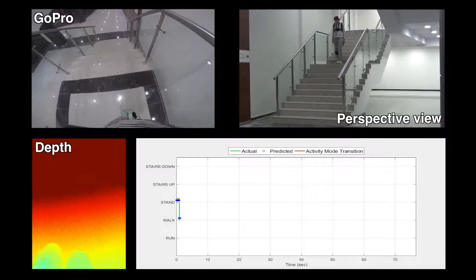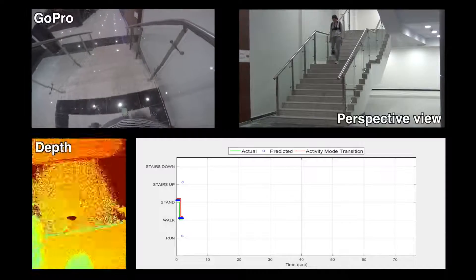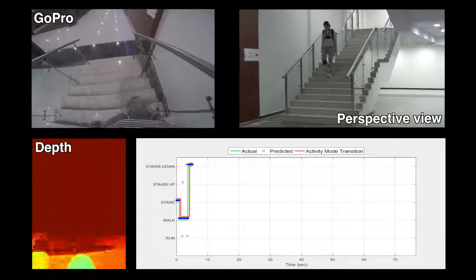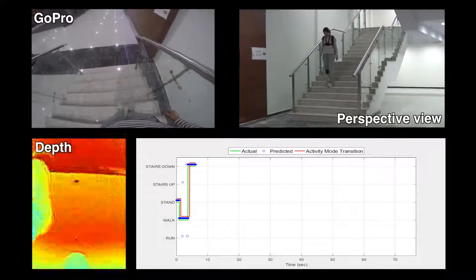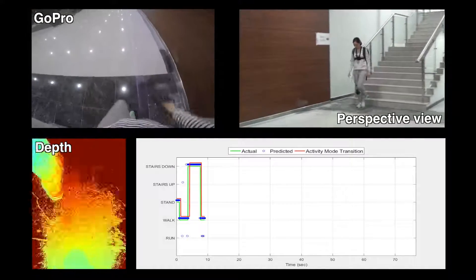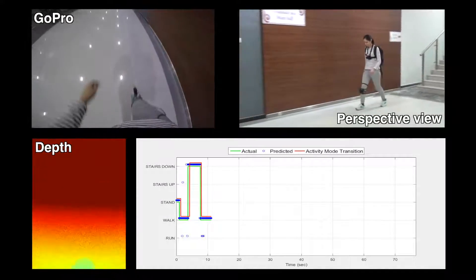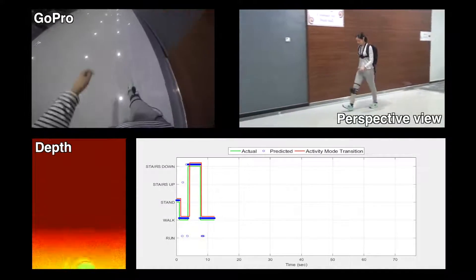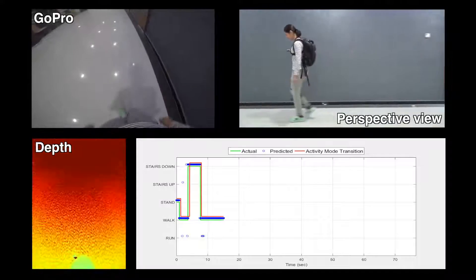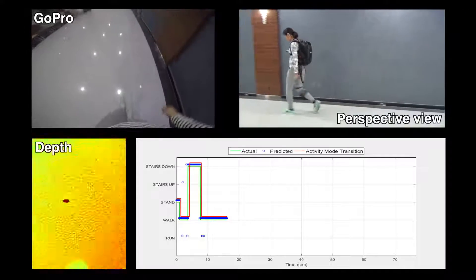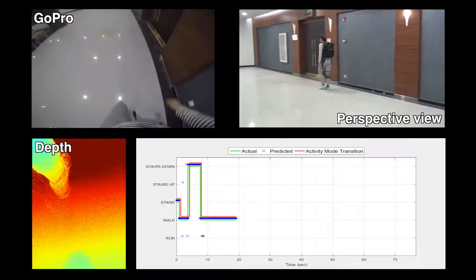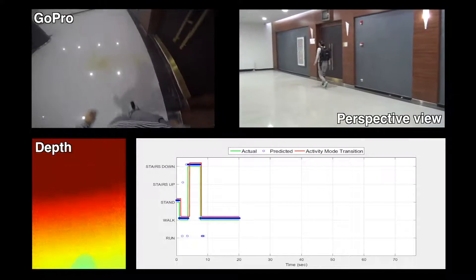We demonstrate the efficiency of our method with an experimental video. In this video, the subject was asked to follow a random tour that includes standing, walking, running, and going up and down the stairs. We used a voting filter for robust activity mode switching.